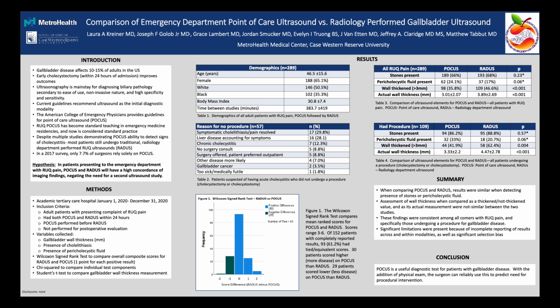And over the years, the need for this study has definitely been obviated a little bit because as point of care ultrasound has grown, it's become more ubiquitous, more people trust and understand kind of what's going on. More surgeons are willing to take patients to the operating room based on our studies, at least in my experience here. But this goes along with a couple other papers that have been published in the last few years saying, okay, if I do the ultrasound and then I follow it up with a radiology performed ultrasound, are they different, right? Our hypothesis is that they weren't, right?